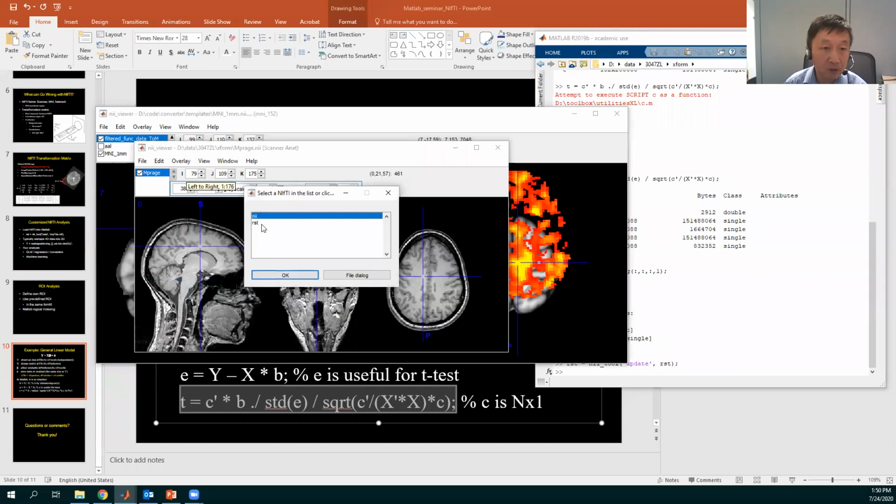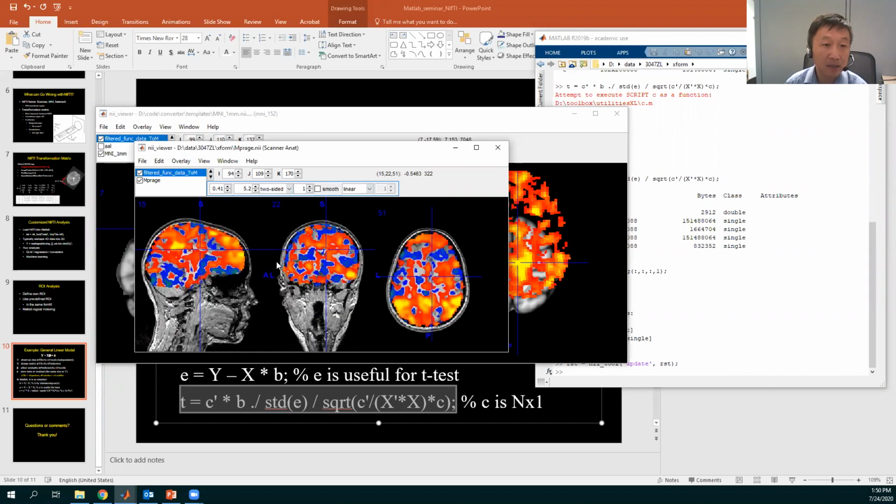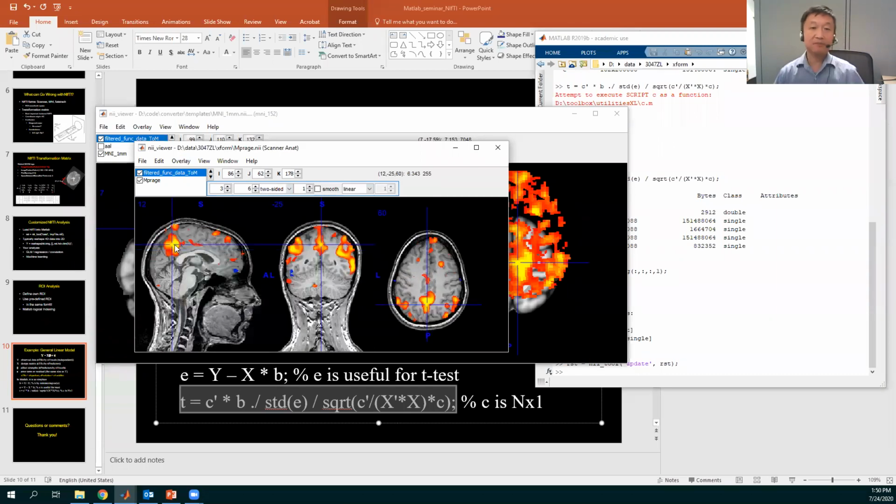Now I'm going to do the result in memory. I didn't even save files. We could do a NIfTI save. That looks inside the brain, right? So we can do an interpolation and two-sided to increase the threshold. Okay, now we have the activation.